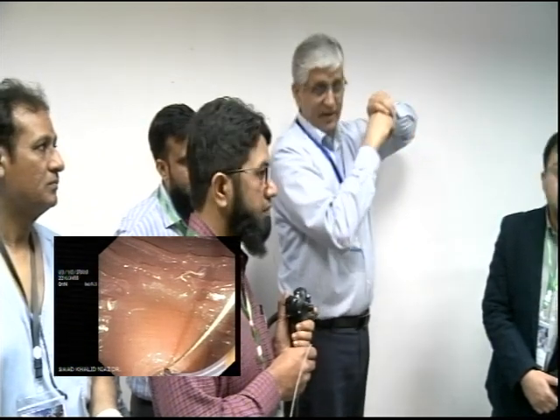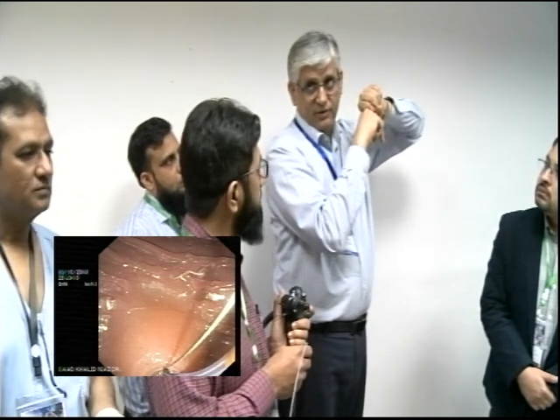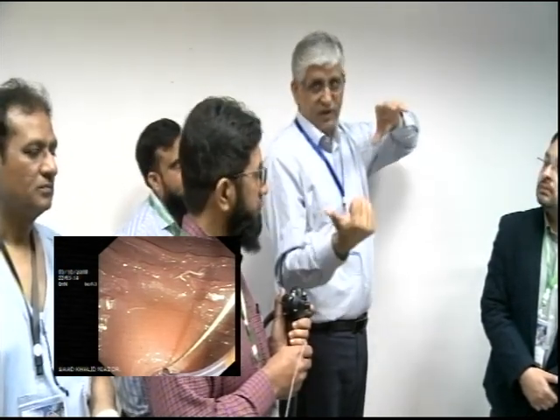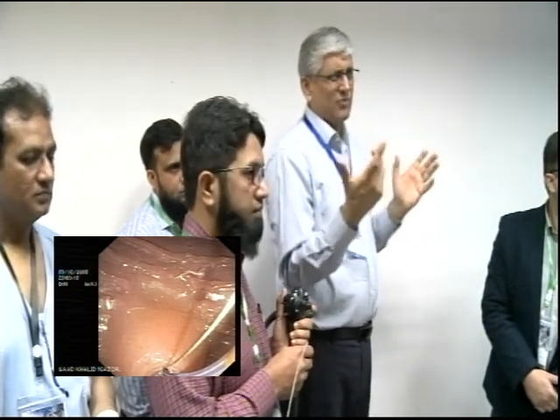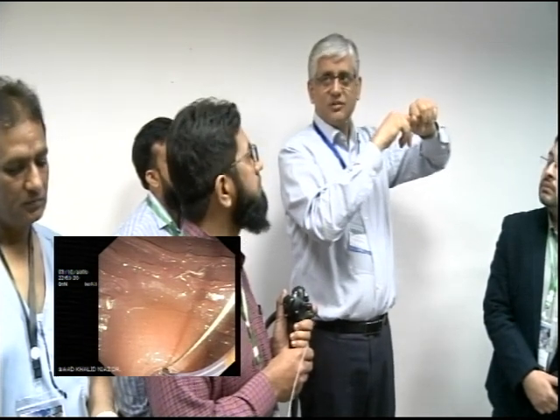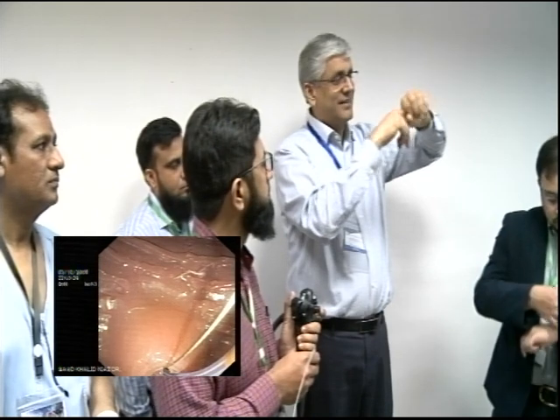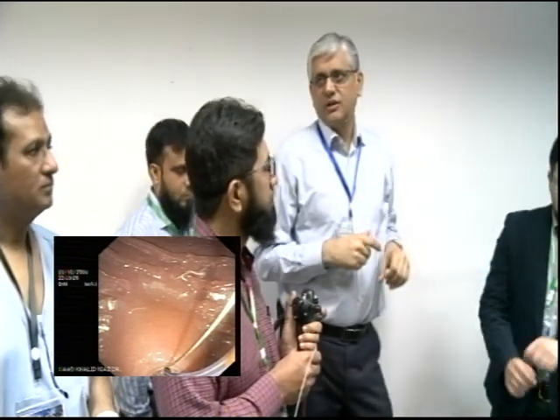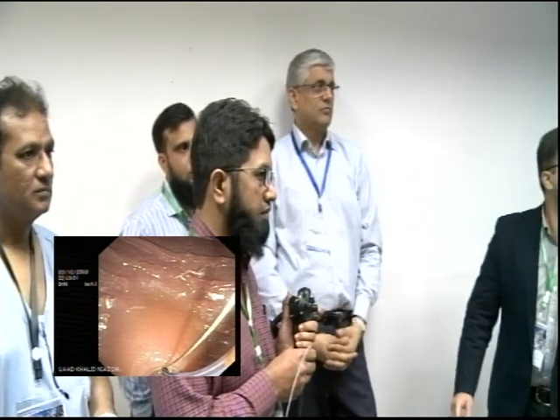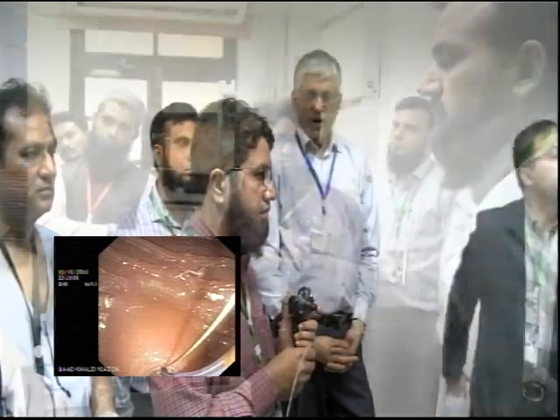I'll ask these two, but I'll tell you my practice. Majority of the cases, the ampulla comes to me. Okay. Big wheel, down, pull down, back. Down, just, because once I'm in the right position, I know where I am. I just want to bring the ampulla like this and a little bit like this for CBD. So your small wheel comes into play. Wire dalo.